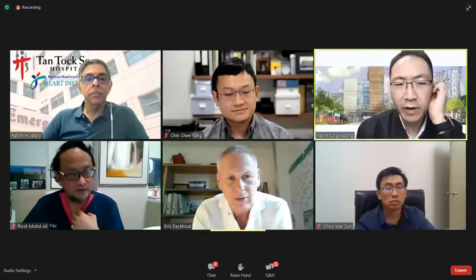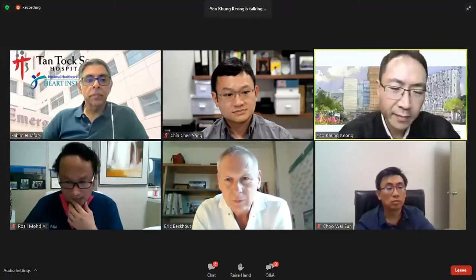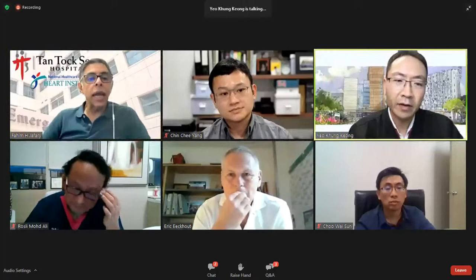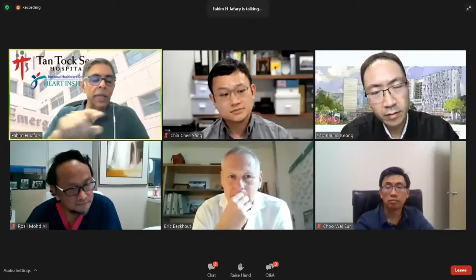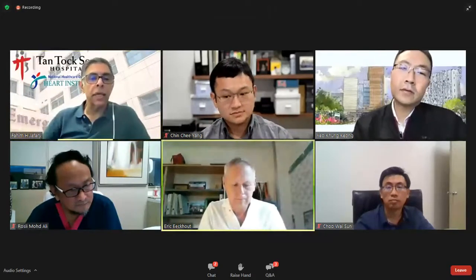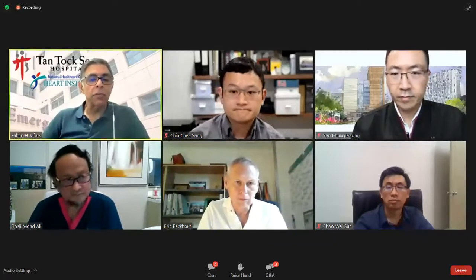I have a question for Faima. I forgot to ask. Did you mention which wire you used with the Supercross? The wire was a Fielder XTA. Okay, right. Because essentially the LAD was a functional CTO-esque vessel. So I find that in that situation, the 0.009 tip of the XTA, or an XTR, somehow seems to work quite well for me.